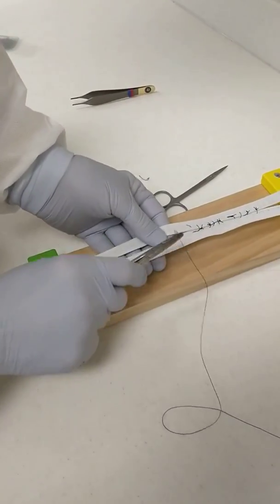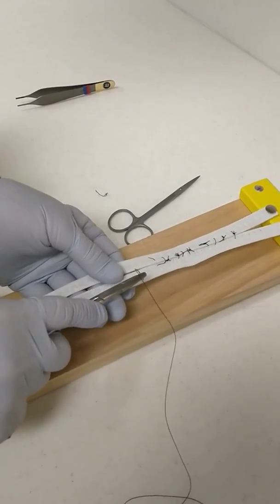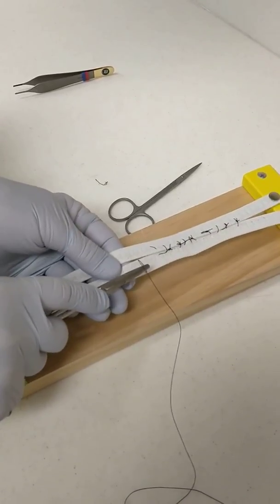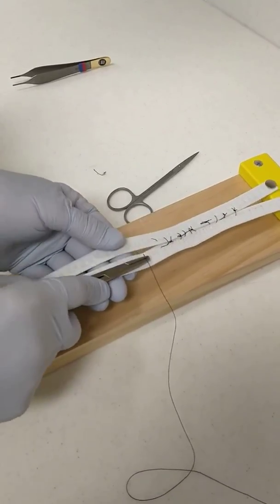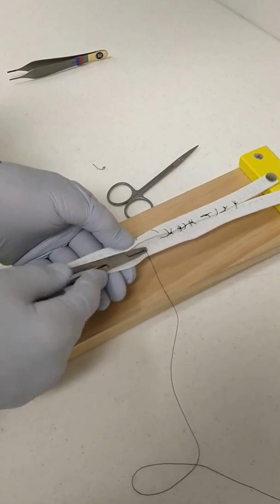First of all, a vertical mattress suture is used to pull the tissue up. And you take a very large bite on your initial pass.